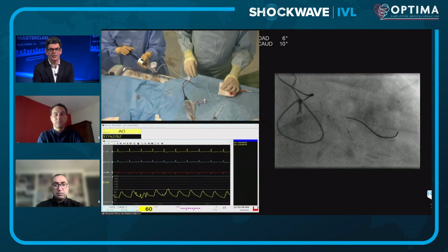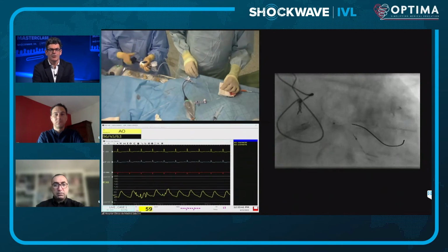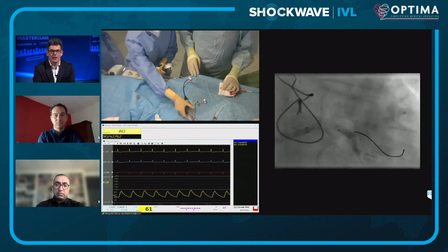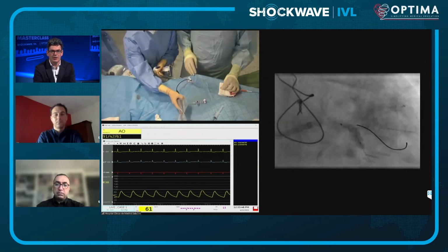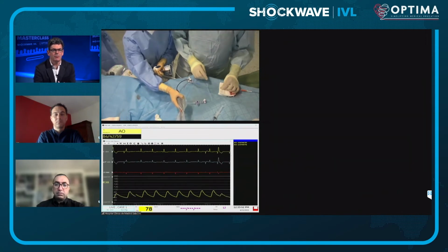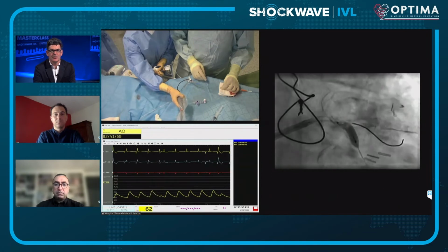So let's go back to 4 atmospheres. It's fair to say that when you see these shock pulses, the pressure may go down transiently. I think probably, but there are no long-term sequelae here. You can see them there now.